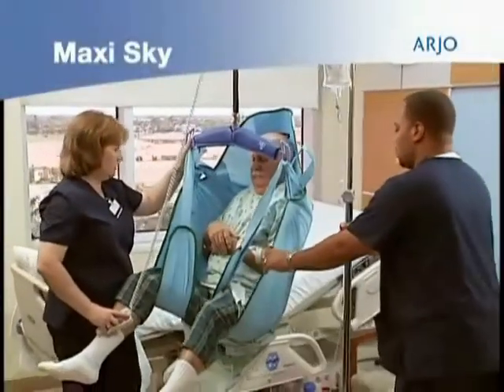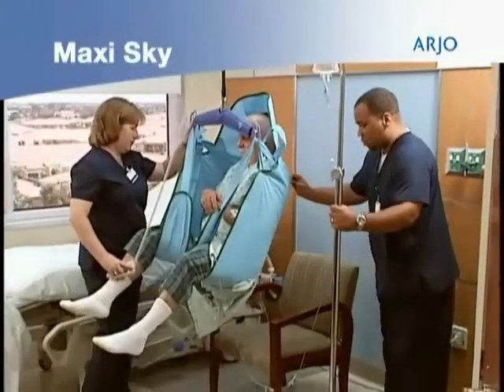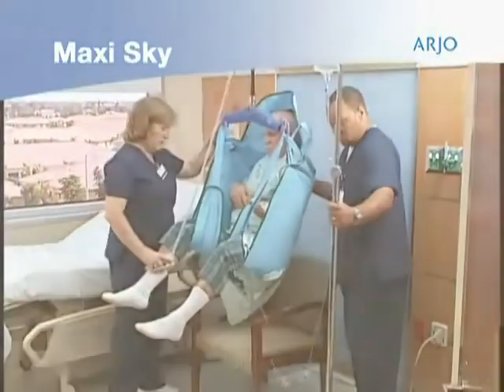MaxiSky is ideal for lifting from floor, chair, or bed to improve the quality of care wherever passive lifting is needed.